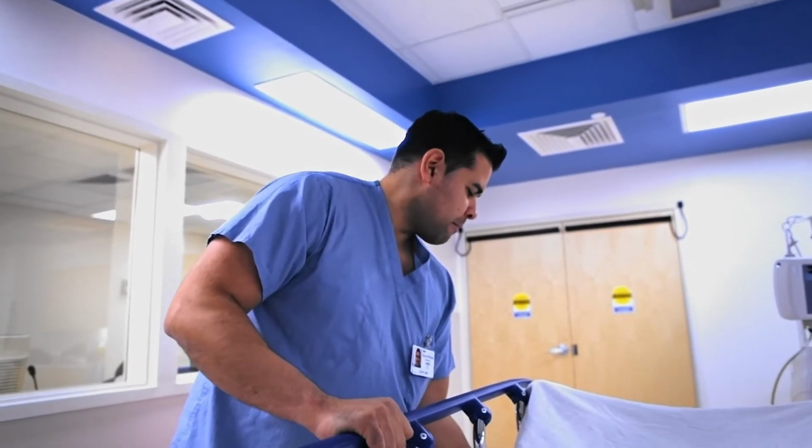Did the doctor explain why you're here today? Okay, we're going to do a cardiac catheterization. Now what we're going to do next is put a hard board underneath you, and then we're going to slide you onto our table, okay?